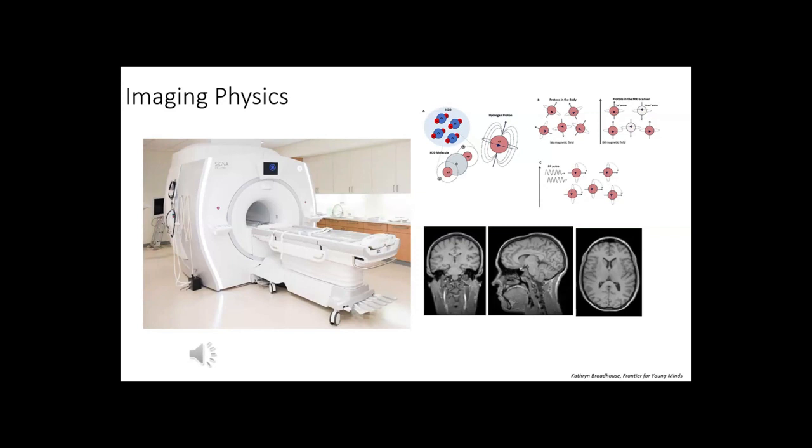Of course, there's a lot of physics in this, how to design a machine and how to program the sequence, because this is really related to the tissue you are going to look at. Because that is a frequency, a common frequency that has to resonate with the tissue. So that's why we call this MRI. R stands for resonance. So you have to carefully design this frequency aligned with the tissue. Okay, all right. So it's complicated.